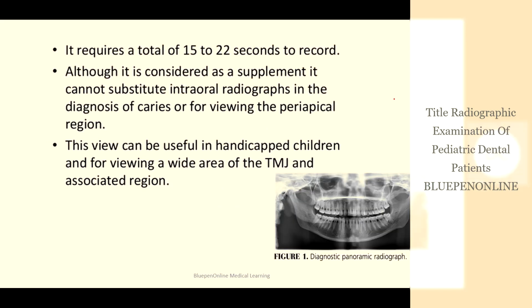Totally, it requires about 15 to 22 seconds to record. Although it is considered as a supplement, it cannot substitute intraoral radiograph in the diagnosis of caries or for view in the periapical region. This is also useful in case of handicapped children and for viewing a wide area of the TMJ and associated region. So this is one of the OPG. Here you can see full view of the mandible, maxilla as well as the entire dentition.